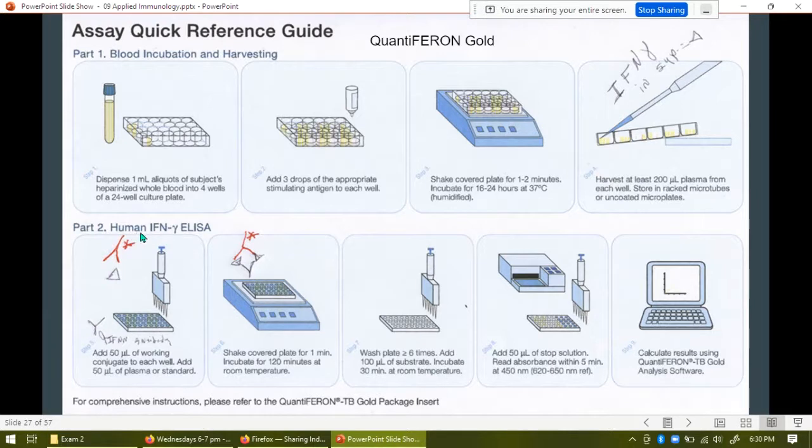And then you add it to an interferon gamma sandwich ELISA. Now, on this plate, you have antibodies against interferon gamma. You have antibodies coated on the plate that are specific for interferon gamma. So their FAB region is facing up. Their FC region is literally conjugated to the plastic by a covalent bond. You add the supernatant from your test, from your sample, into each well, and then you wash to wash out all of the excess interferon gamma that hasn't bound to antibody.